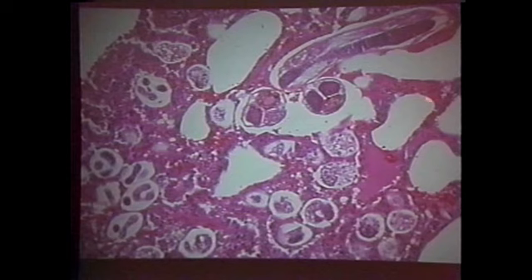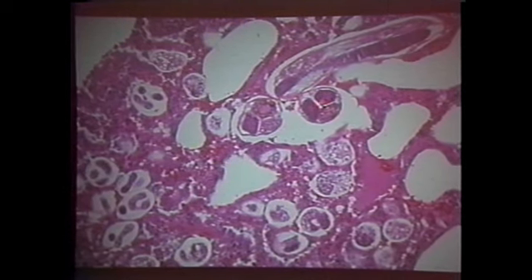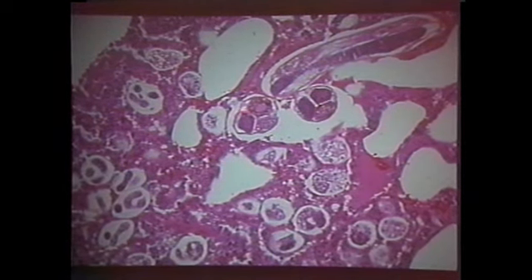This is a lung with a consolidation here, and you look, and it's adult worms and larvae. Of course, they're lungworms. They're worms in the lung, right? Okay, what sex do you think that is? Female. And notice how there are larvae developing here. Here is the intestine. Look at that. Large and composed of few multinucleated cells.